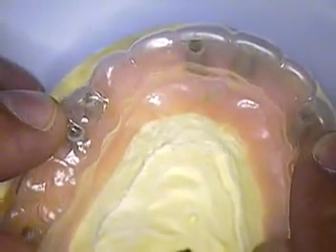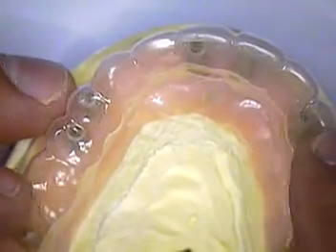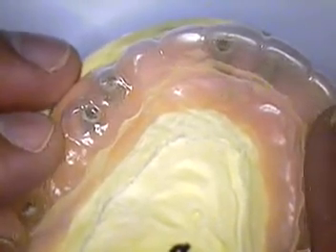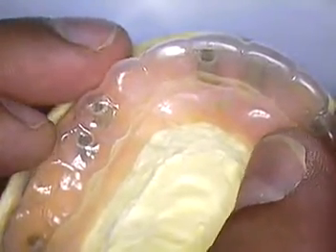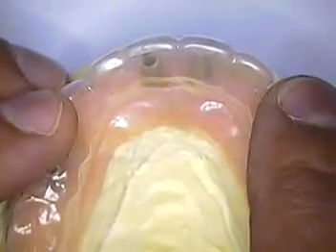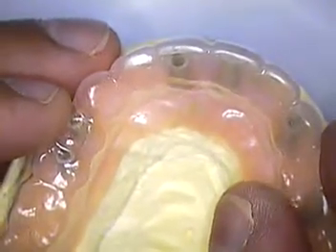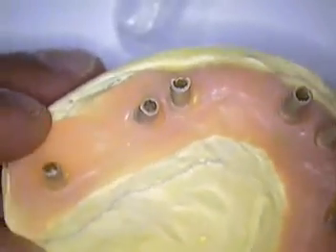An Omnivac was made from the accepted temporary model, temporary impression of the final temps, and of course we will be modifying this case even a little bit further, but our goal today is to show you how we're going to superimpose the outer image of the final accepted provisional shape to that of the Straumann temporary wax up abutments.